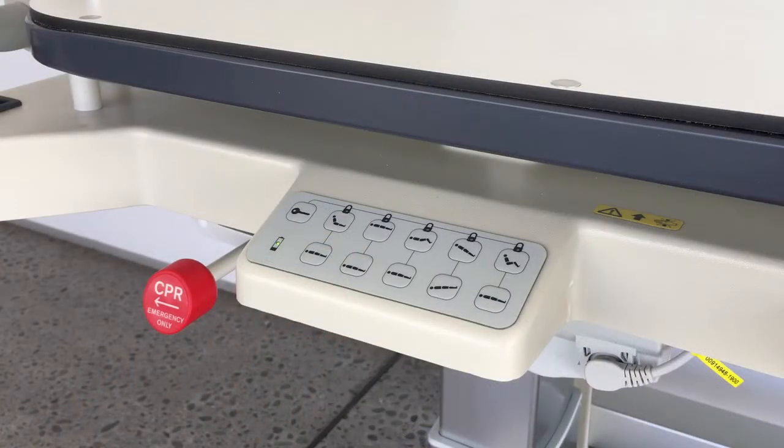When the battery is fully charged, the LED on the attendant control keypad will be green. When the battery is low, the LED will be red and the battery needs to be charged.